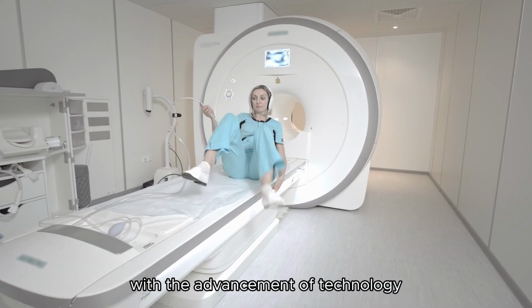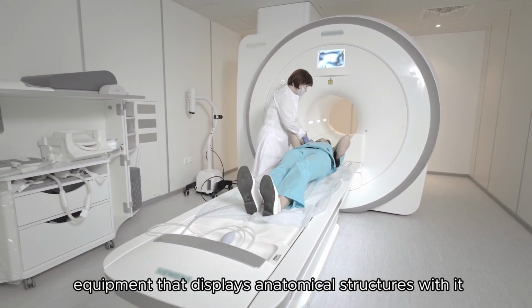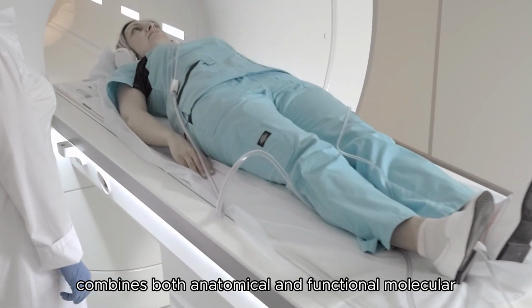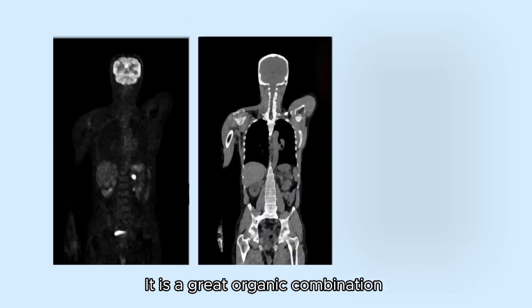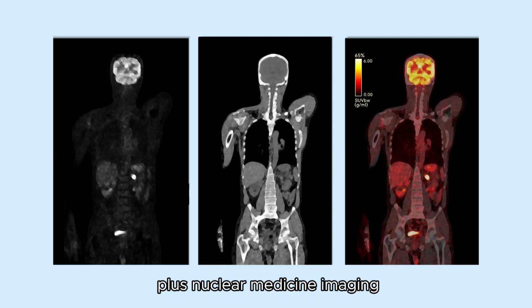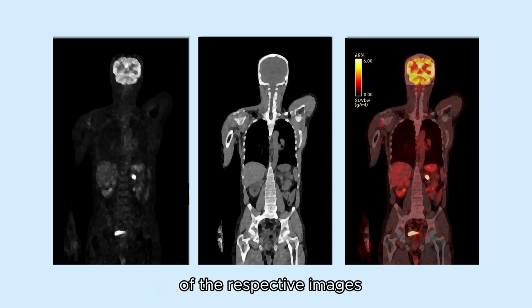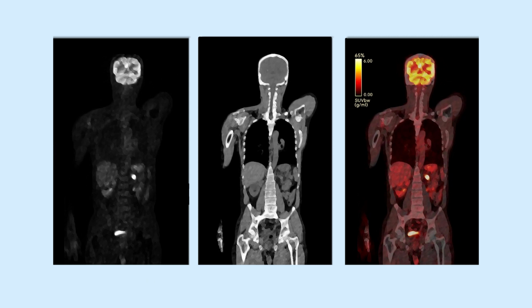Around 2000, with the advancement of technology, equipment manufacturers organically integrated CT equipment that displays anatomical structures with it, forming a new generation of hybrid modality that combines both anatomical and functional molecular images, i.e. PET-CT. It is a great organic combination and success of radiological anatomical imaging plus nuclear medicine imaging, which greatly enriches the amount of information for disease diagnosis and makes up for the shortcomings of the respective images, achieving the result that is greater than the whole.